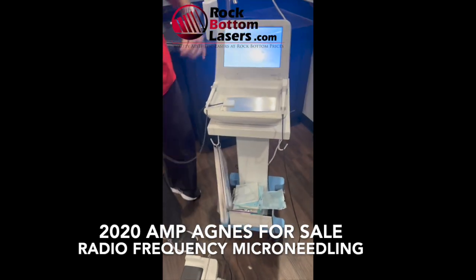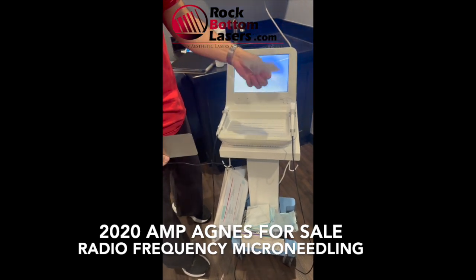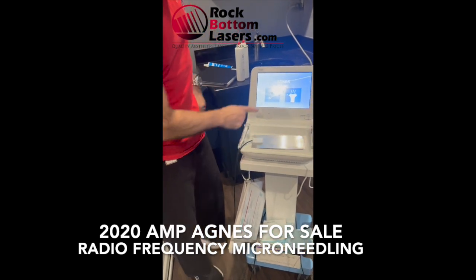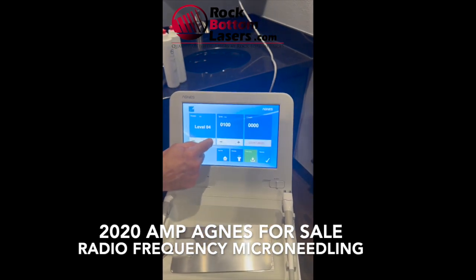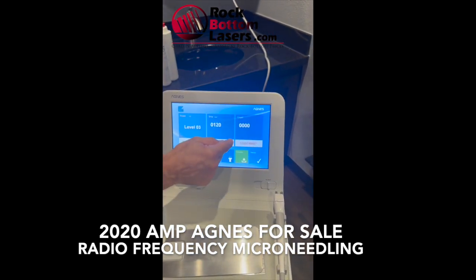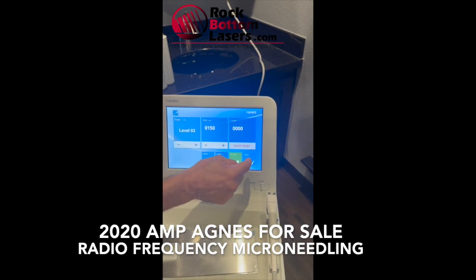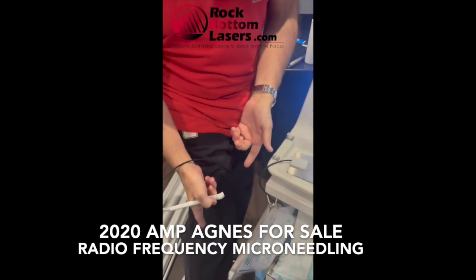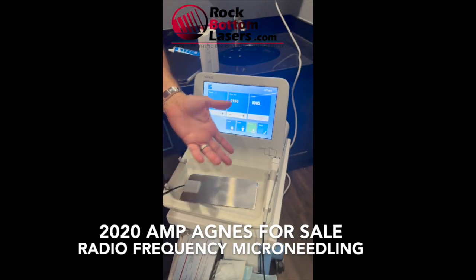Here's the manual and the attachment cords. This is the grounding device, and this is the cheat sheet for the settings. This is the AGNES — levels go up or down, and here's the time. When it's ready, essentially, this is attached, here's the pedal, and there's your count.